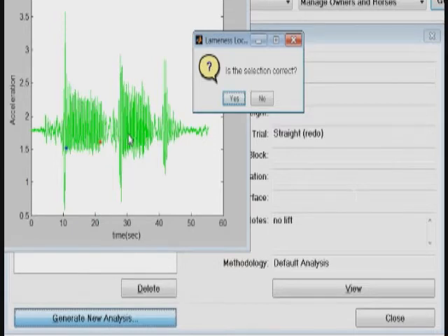In this case, however, note that when the horse trotted back to the examiner, no trotting strides were selected when they should have been. If the evaluator would like to include these trotting strides in the evaluation, which is advisable, then the window around the median stride rate should be increased above the default value of 0.1. The user should select No.